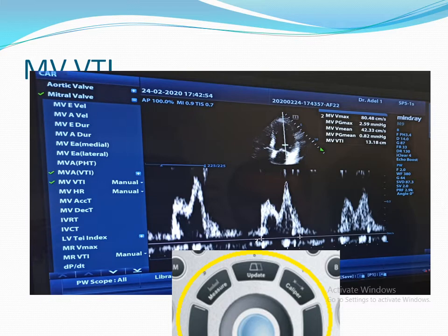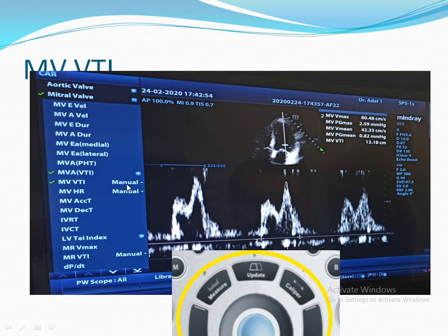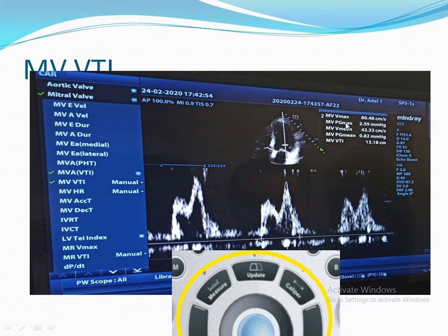If you want to measure the maximum pressure gradient, mean pressure gradient, and Mitral Valve VTI, you have to press Measure, then choose Mitral Valve VTI — manual or automatic. Then you will start tracing from the beginning of the wave until it ends. After that, you will get the maximum pressure gradient, mean pressure gradient, and Mitral Valve VTI.